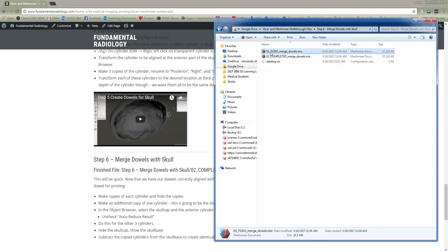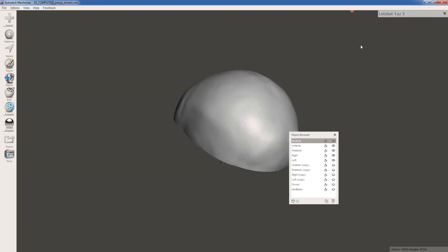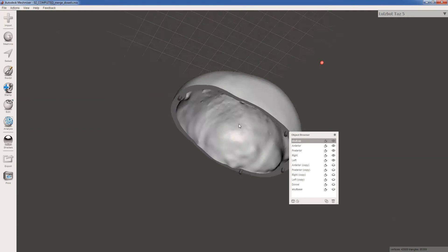You're going to work from the 01 to-do merge dowels MeshMixer file. I'm going to work from this completed file, and then when I'm done, you're going to have access to the completed version of the file as well. So I'm going to double click on this, open up the file, and this is where we left off.